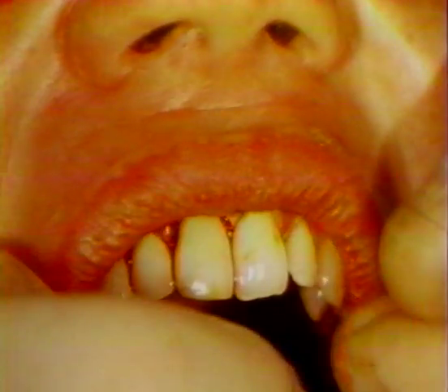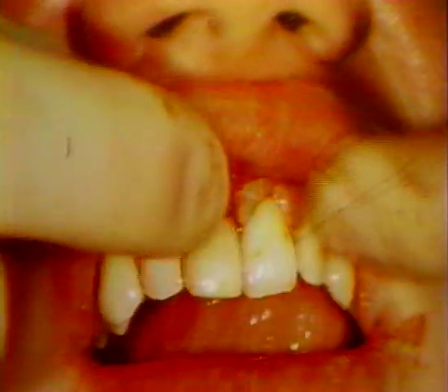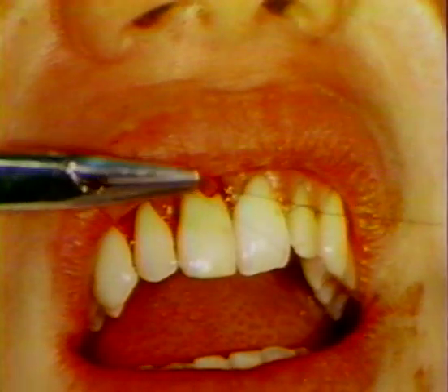One end of the suture is pulled through the interproximal space between the left central and lateral incisors, and the other end between the lateral incisor and cuspid. As the ends of the suture are tied, the flap is drawn mesially and palatally.